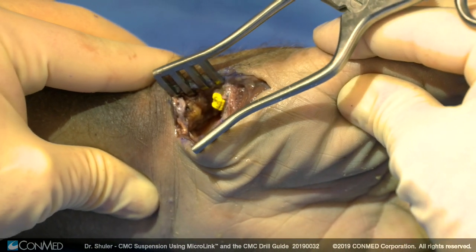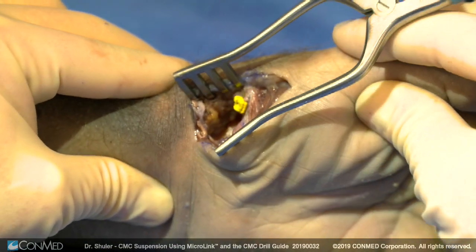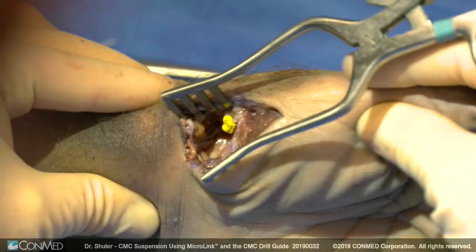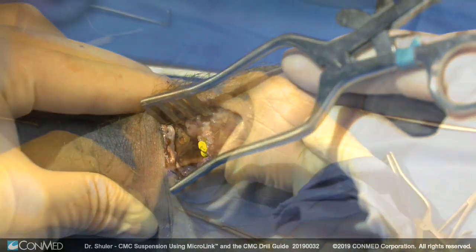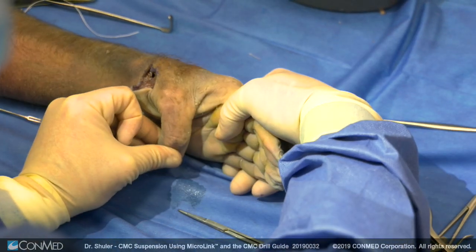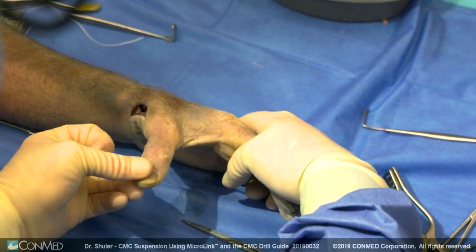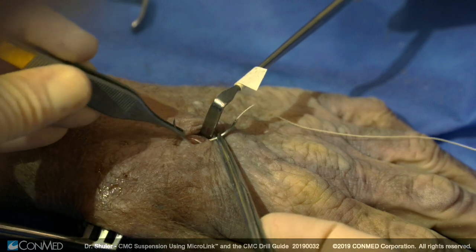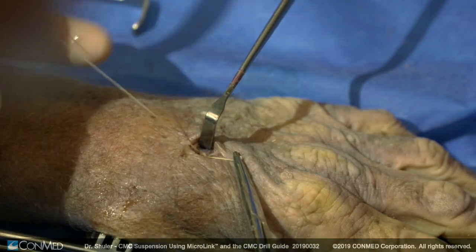Prior to closing, axial loading can be performed as seen here. The axial loading demonstrates the stability of the all-suture button, which prevents proximal migration of the thumb metacarpal. There is no abutment of the thumb metacarpal on the scaphoid even at this stage intraoperatively.